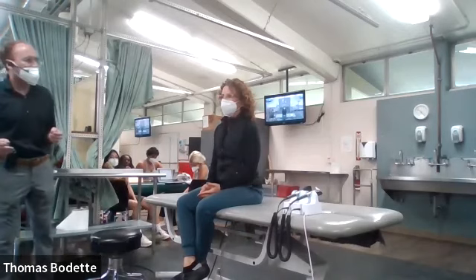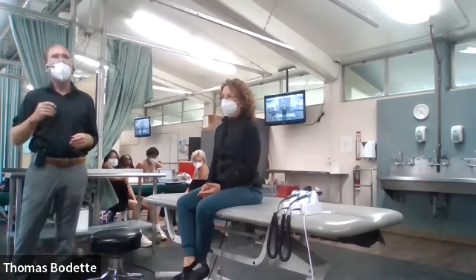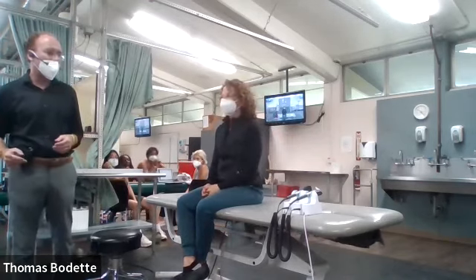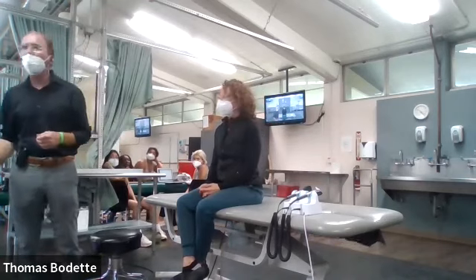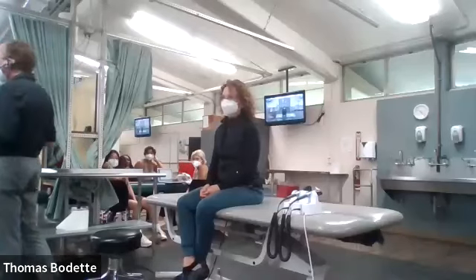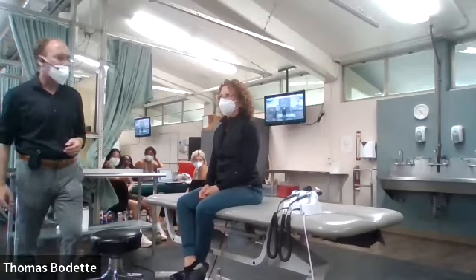So as promised, I'm going to step you through exactly what to look for and what abnormal findings to look for, and give you indications in order of the process of evaluating the eyes. As some of you have already discovered, there are a lot of abnormal findings and a lot of indications that you can identify on ophthalmoscopy if your technique is spot on. Does that make sense? Okay.